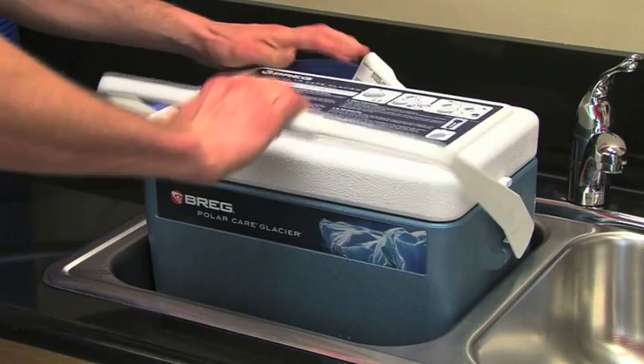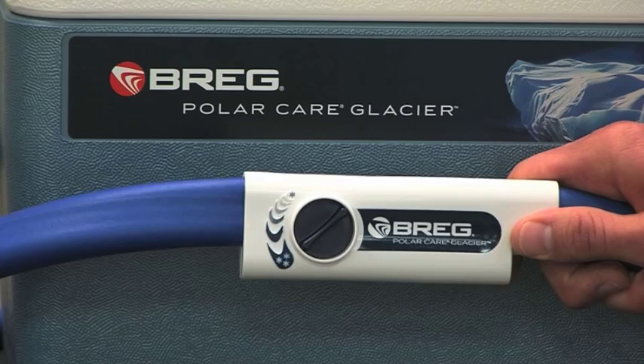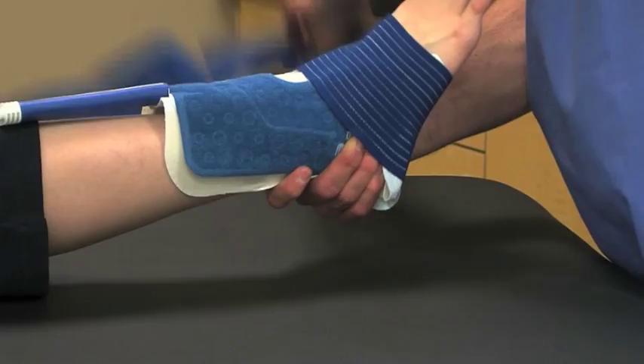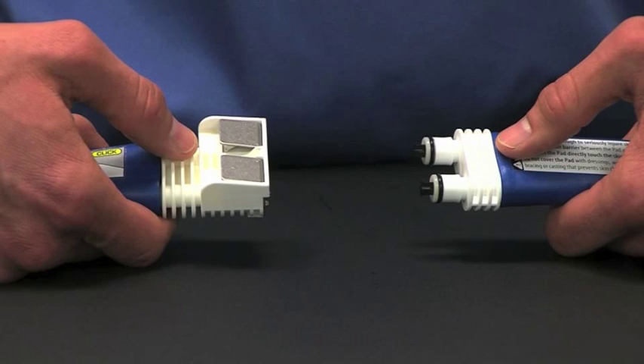Lock the lid into place with the handle. This is the temperature control dial. Start it at the coolest setting – three snowflakes – to set the average surface temperature of the insulation barrier over the pad at or just above 45 degrees Fahrenheit. For pads intended to be used on extremities, such as ankle or wrist, the coolest average surface temperature of the insulation barrier over the pad will be at or just above 50 degrees Fahrenheit. It may be adjusted warmer per the physician's instructions or for patient comfort.